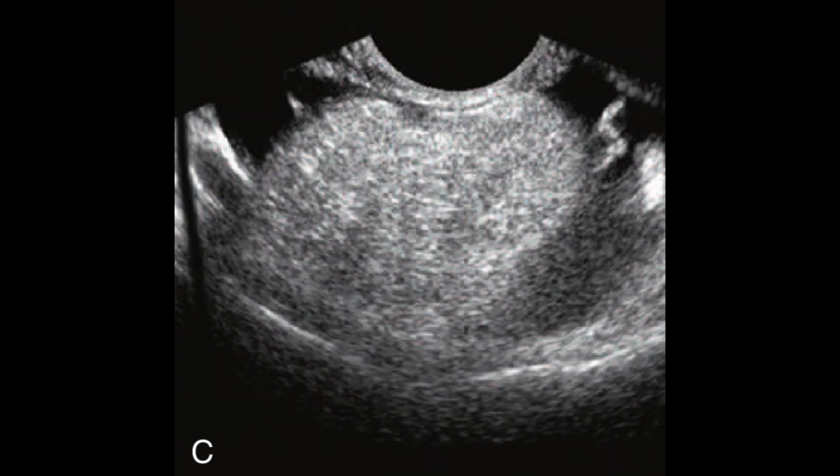This is a particular radiological appearance which is called a characteristic echogenic lesion. It is entirely echogenic. It has obscured the entire ovarian parenchyma. This is within the ovary, and this is another feature and appearance of the dermoid lesion.